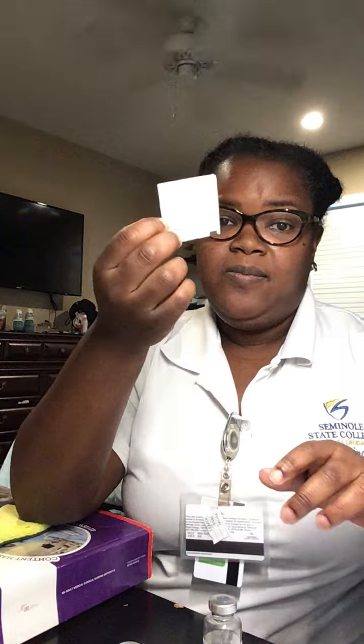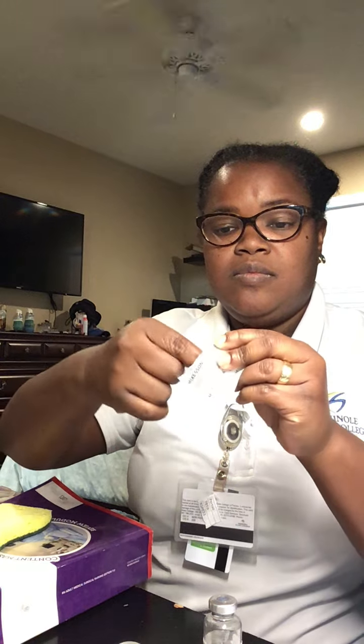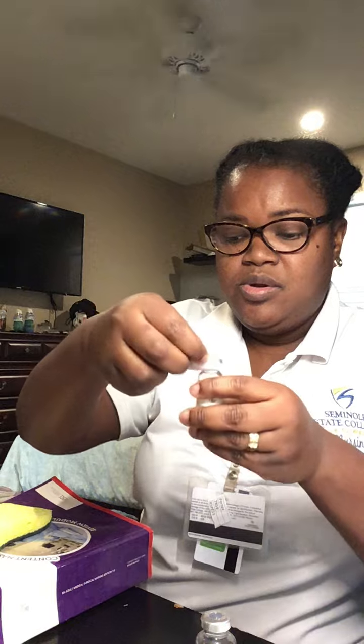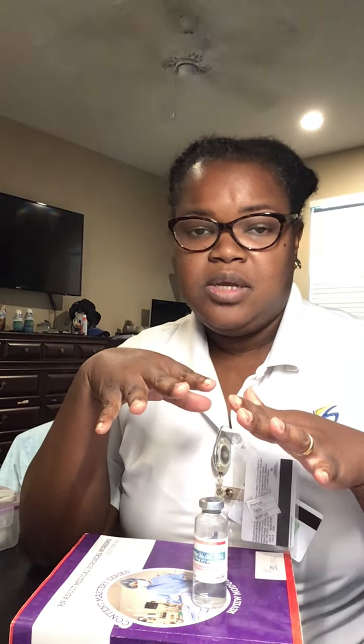I have to now start cleaning up and retrieve my medications. I just need now an alcohol pad. I open it and clean the top rubber of each one. Okay, I discard this. I'm going to use this book so you'll be able to see the whole process.